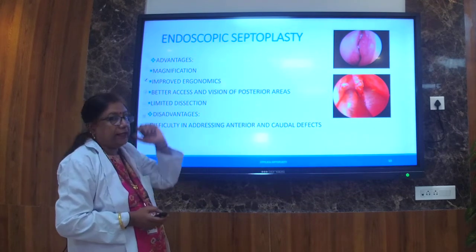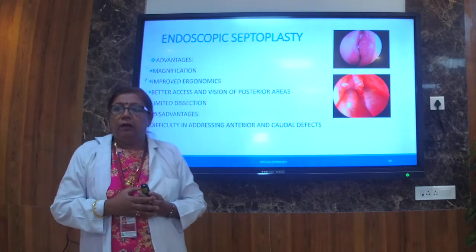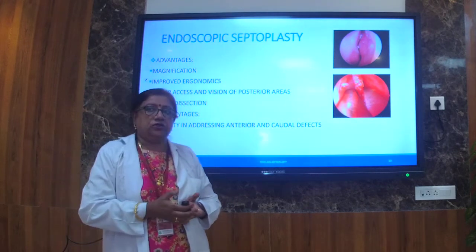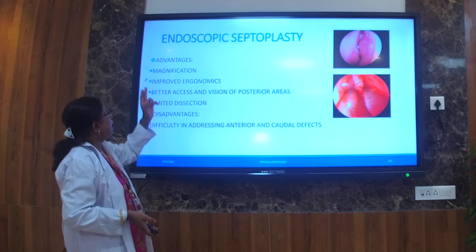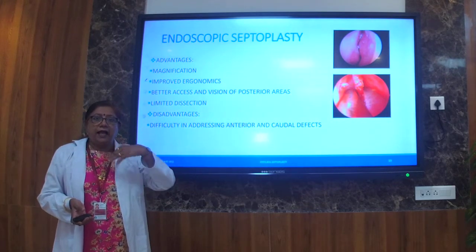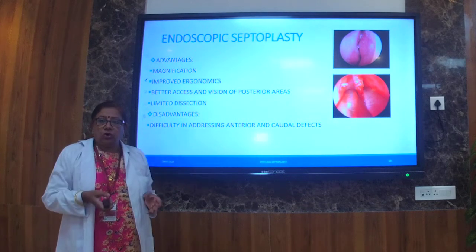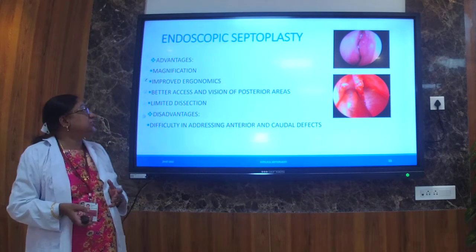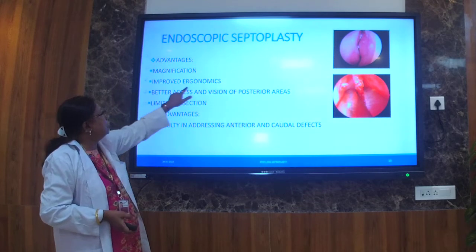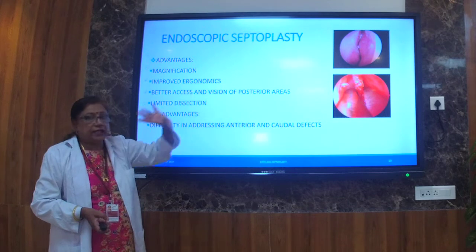So what are the advantages? See, in the open technique also we can see properly, we can do everything. But what are the advantages of endoscopic rather than open technique? Now the advantages are, it is highly illuminated, the scope. So when we see under scope, it gives a high magnification, improved ergonomics, and better access and vision of posterior areas.